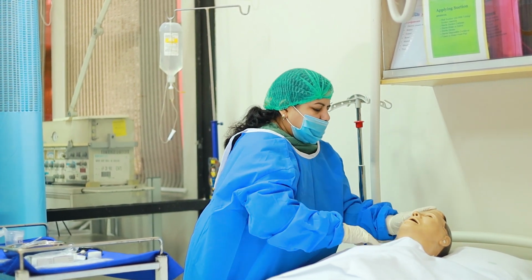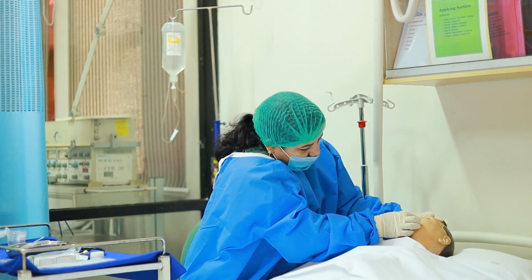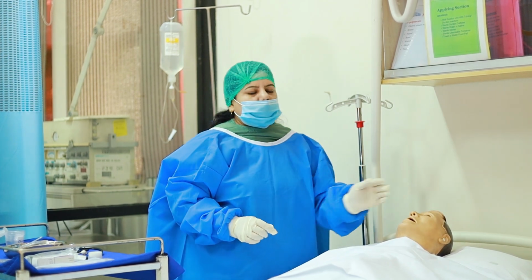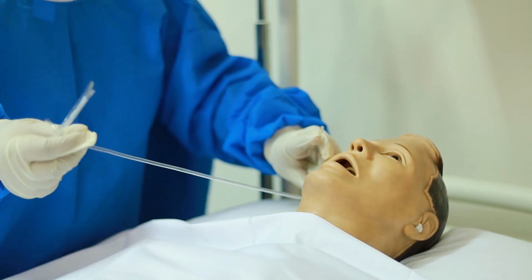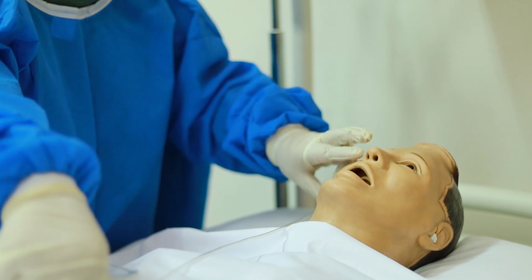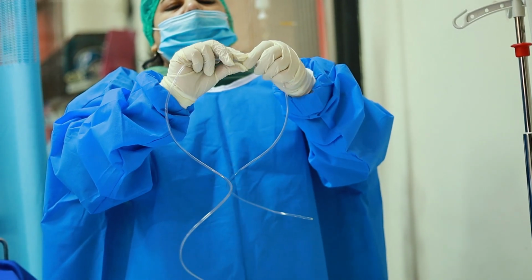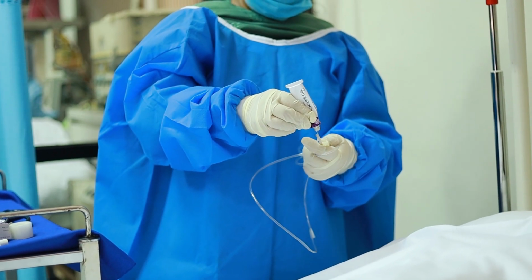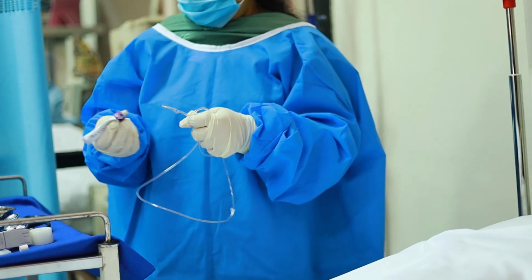Please be with me. So, examine the nostrils for deformity and obstruction to determine the best side of insertion. Measure the tubing from the bridge of the nose to the earlobe, then to the point halfway between the end of the sternum. You can mark that point with a marker or highlight it. Lubricate 2 to 4 inches of the tube with the xylocaine jelly.